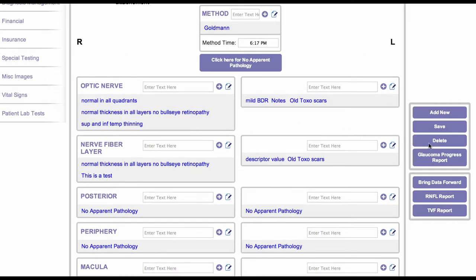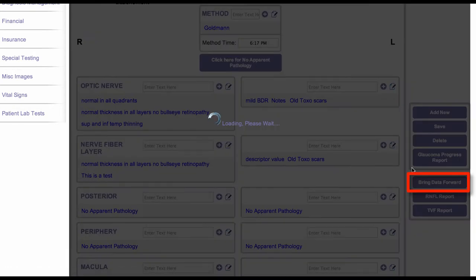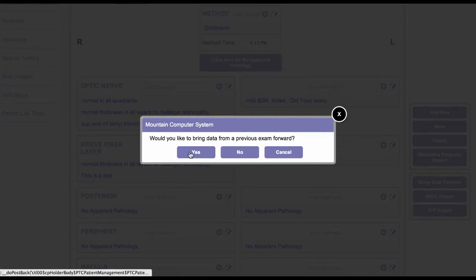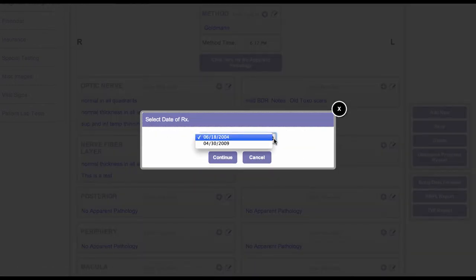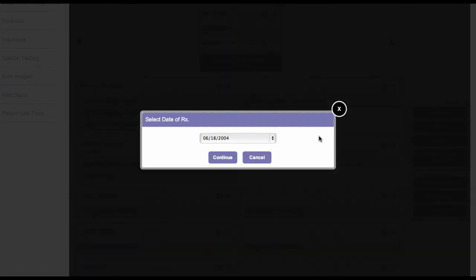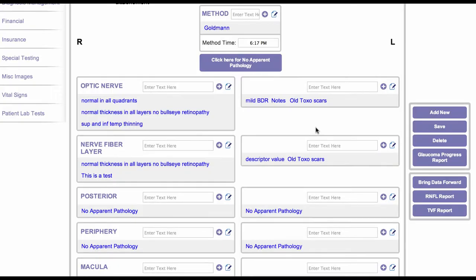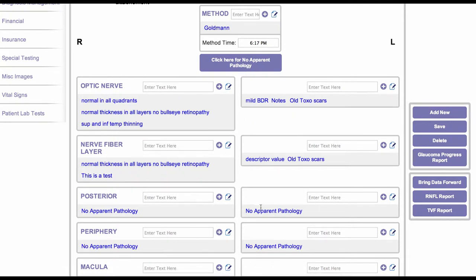You can bring data forward from a previous exam date just by clicking over there on the right, and it'll populate a drop-down box with the previous exams and you can just select one of those and it will populate all the boxes for you. And lastly, you can click the no apparent pathology button which will fill in all the empty boxes.